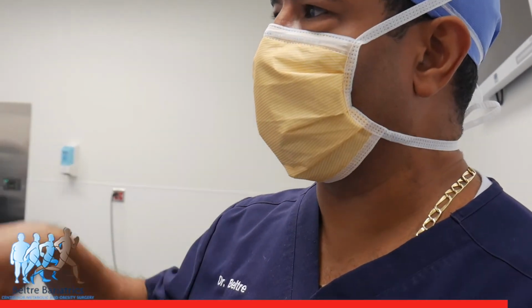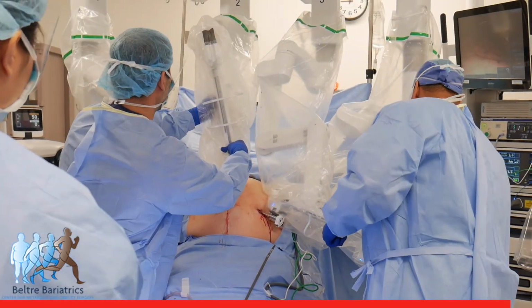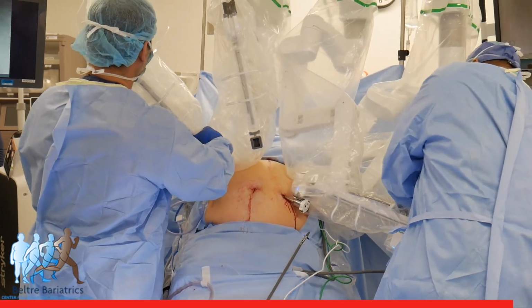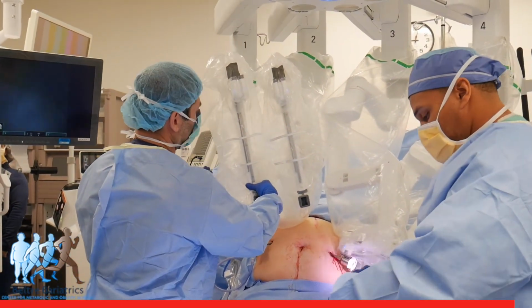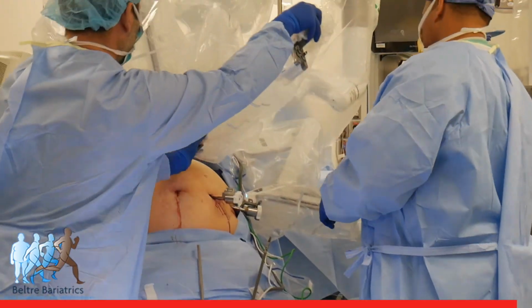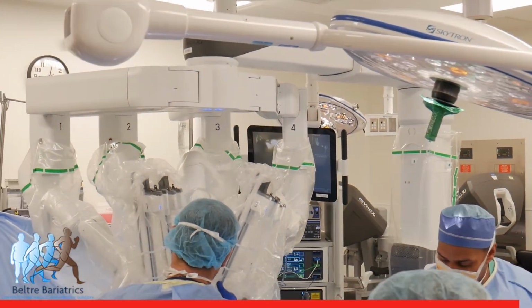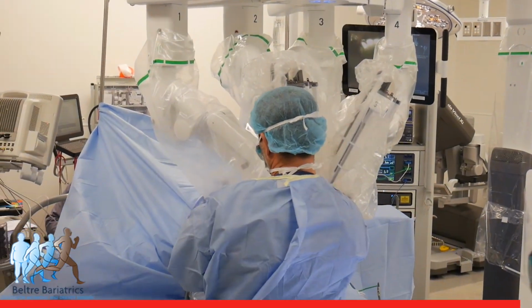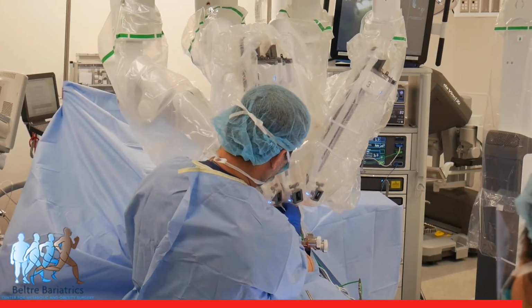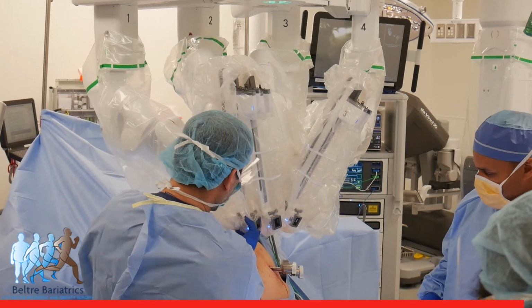And you can watch them undock, the way they undock and close. Now we are disconnecting or undocking the robot from the patient. Ahora estamos removiendo el robot del paciente, lo que le llaman undocking. Aquí es donde removemos los instrumentos. This is when we remove the instruments and detach the robot from the port or the patient, and the robot is just now pushed outside. Después que removemos todo, pues entonces ya el robot ya lo quitamos de encima del paciente y cerramos como hacemos siempre.